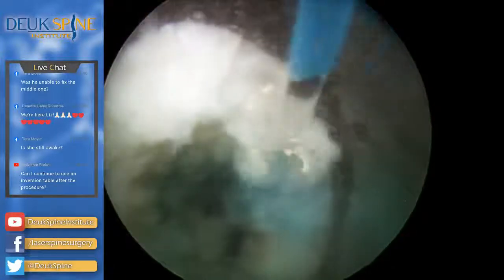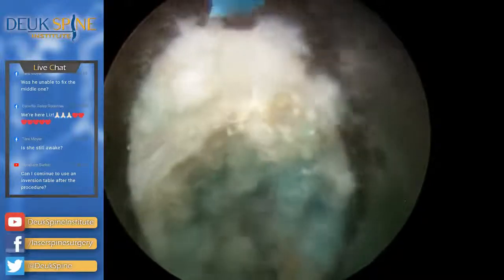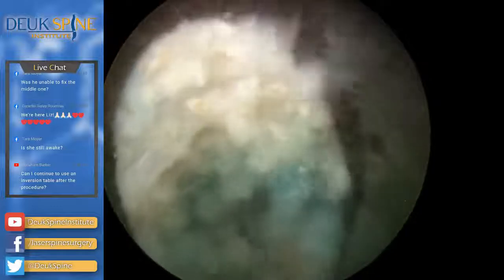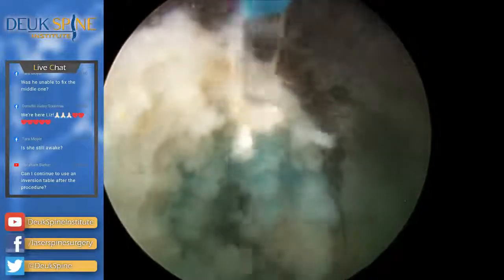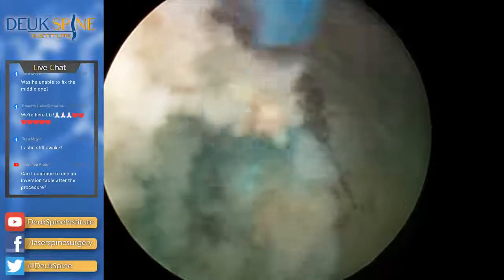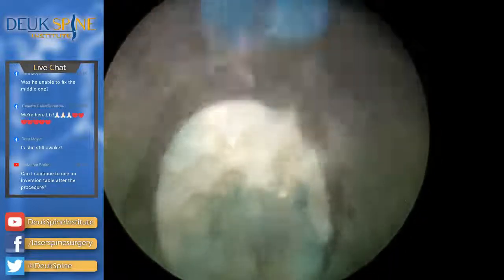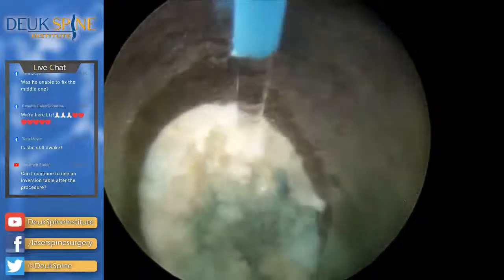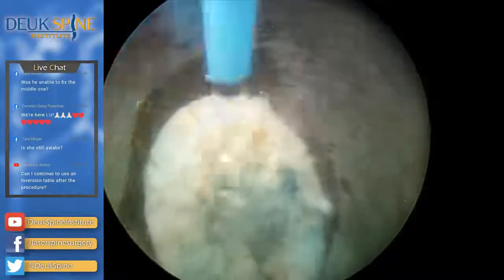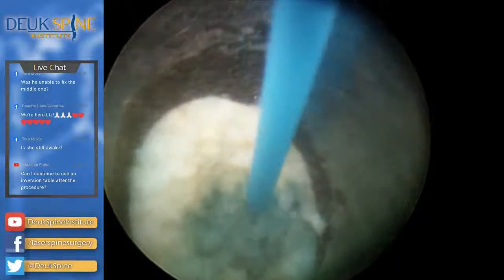So I only use straight firing lasers. I don't use any side firing lasers, but other surgeons do. I tried side firing lasers years ago. 5 minutes, and I just hated it. Not being able to see what I was zapping, and also the power gets diminished with a side firing laser, so you need to crank the power up even higher to get an effect.